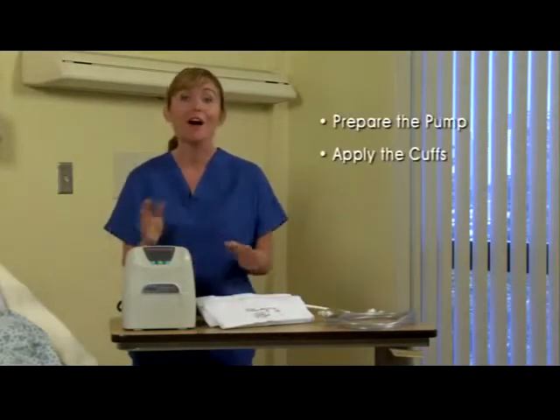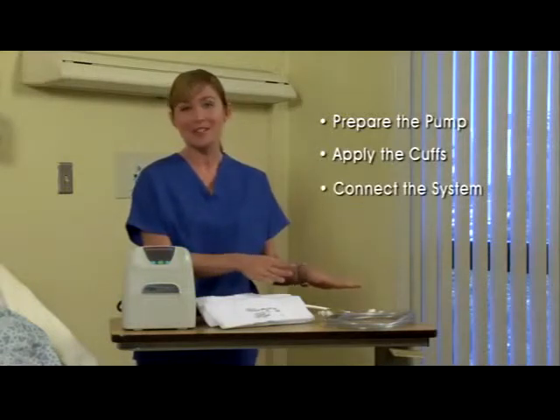This demonstration consists of four basic steps: preparing the pump, applying the cuffs, connecting the system, and troubleshooting.